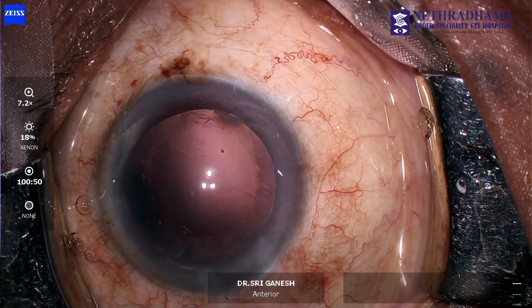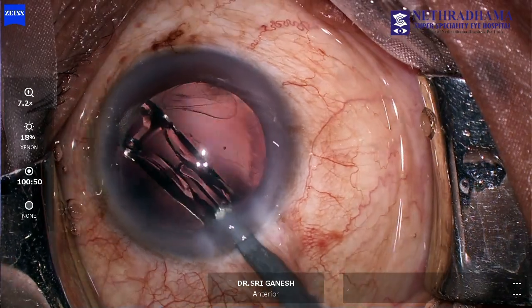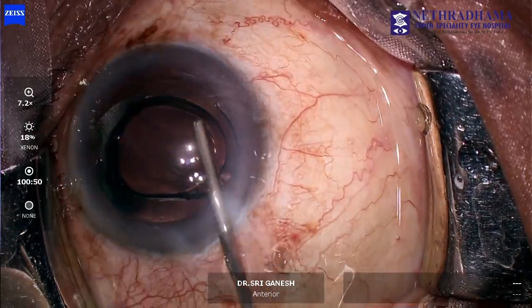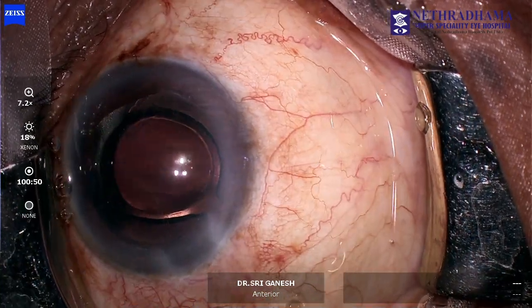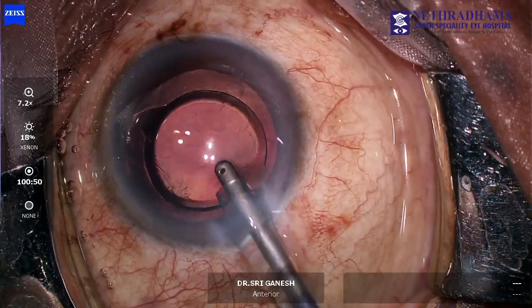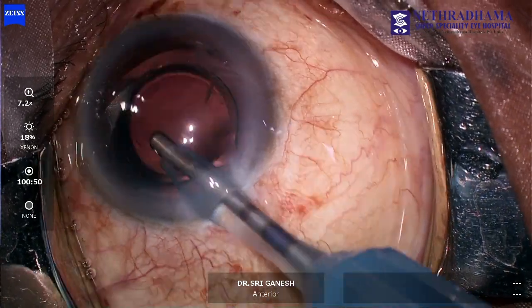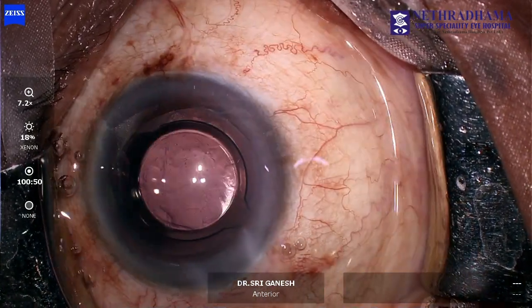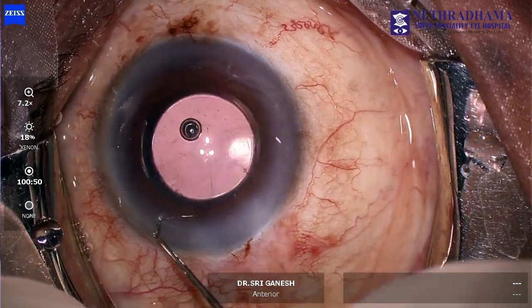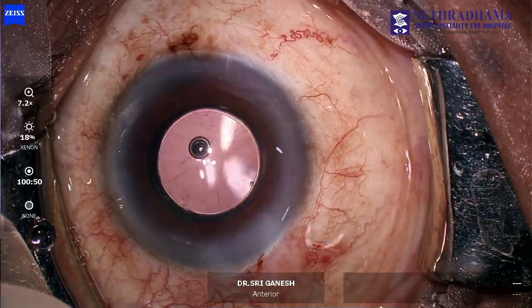Then a single piece IOL is introduced into the capsular bag, and then it is positioned in such a way so that the haptics are placed away from the peripheral PCR, and then the viscoelastic is removed with the coaxial IA cannula. Note that the IOL is very well centered and stable. The penetrating arcuate astigmatic incisions are then opened, and that's the end of the procedure.